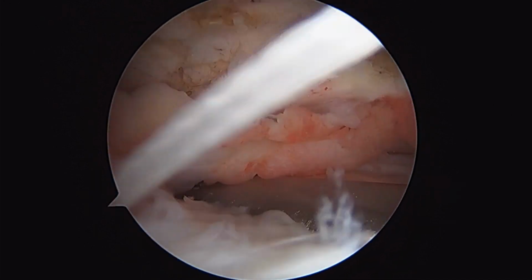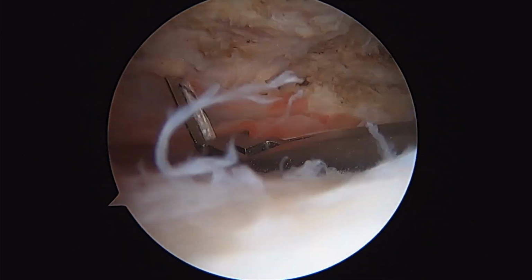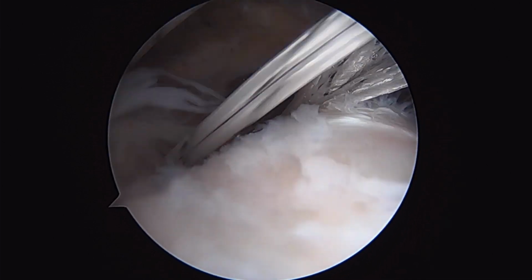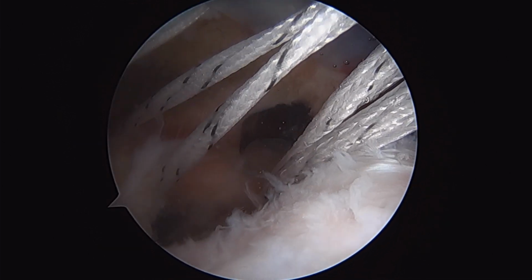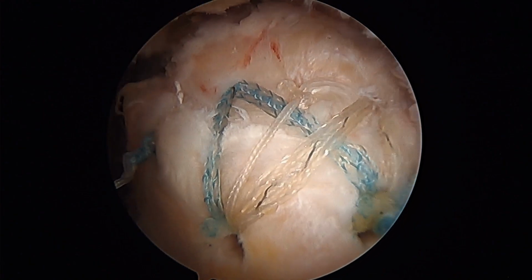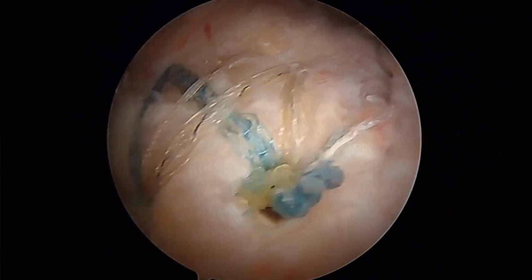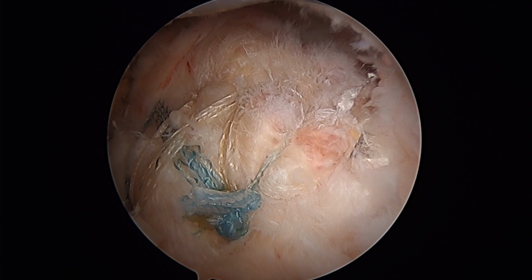After the suture has been anchored to the bone, a suture passing device is then used to shuttle the sutures through the tendon and facilitate repair back to the bone. The sutures can either then be tied in place or placed into additional anchors at the edge of the bone. The final repair is visualized from the lateral portal, demonstrating attachment to the greater tuberosity of the humeral head.